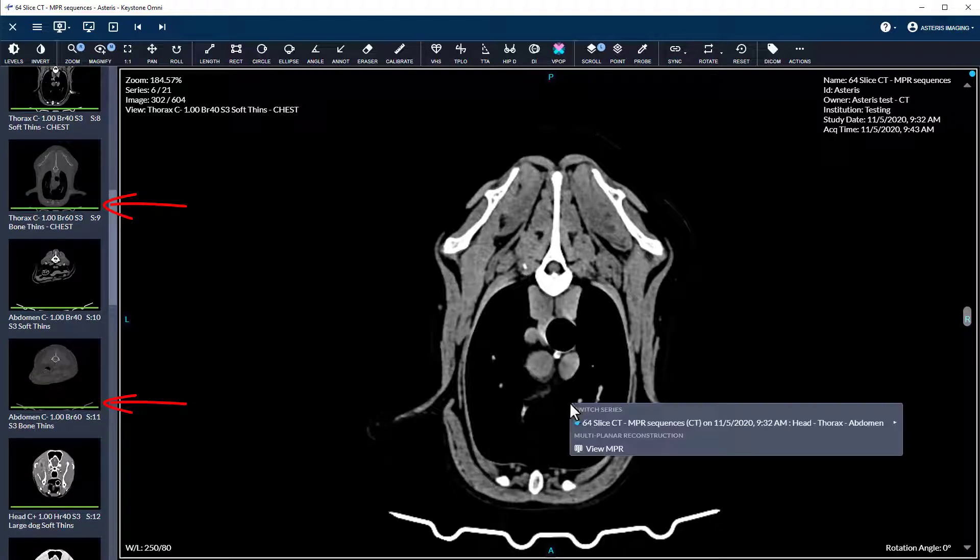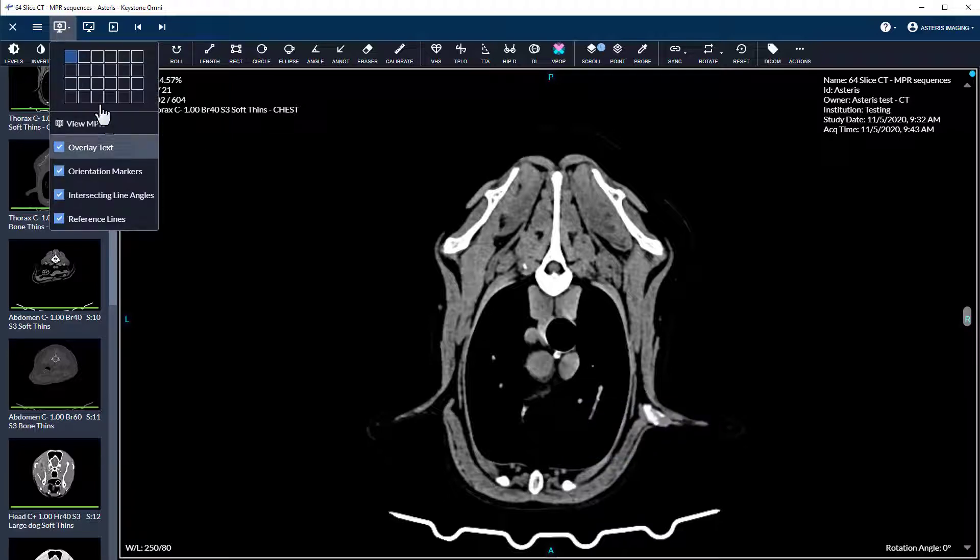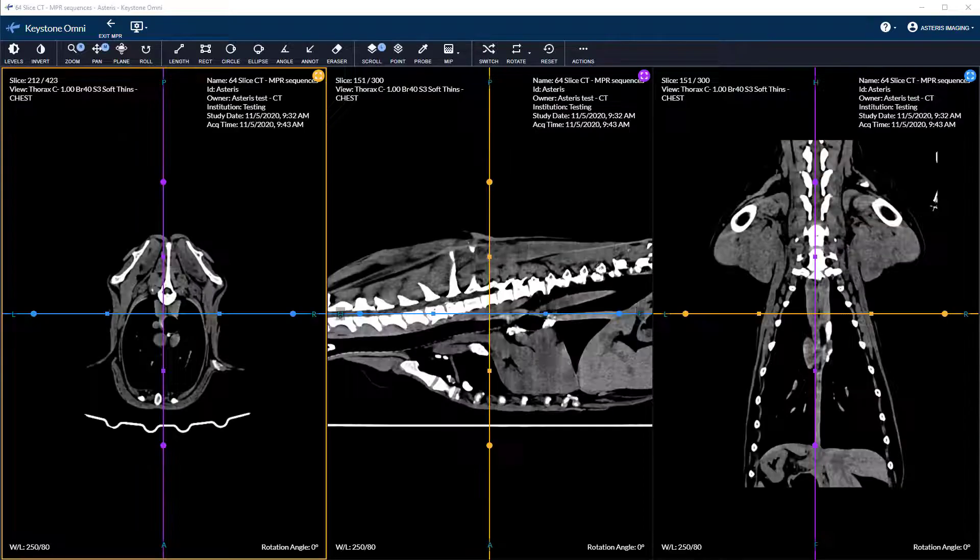Now you can either right-click or select the viewer settings to activate multi-planar reconstruction on the highlighted sequence.